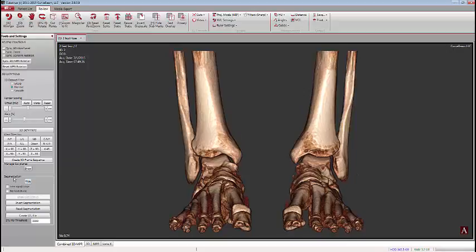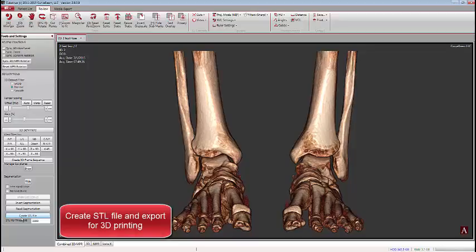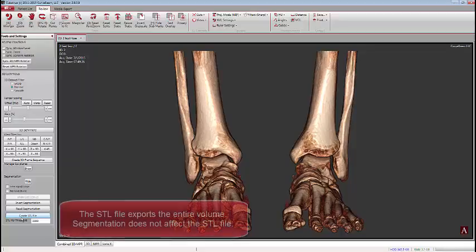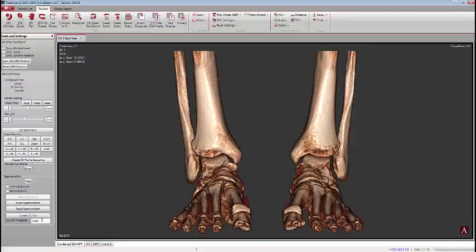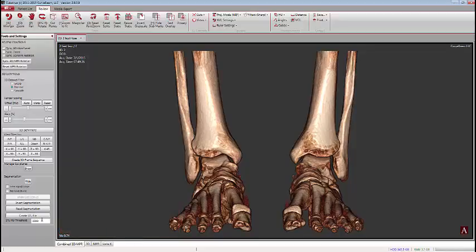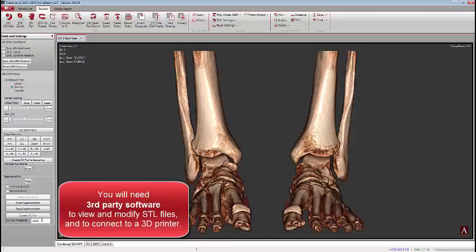Under the segmentation section there's also a tool called Create STL File. STL files are used to create actual solid objects using rapid prototype printing. To use STL file creation, you need to understand that it exports the entire volume — any segmenting done using Freehand Erase or Remove Bone will not carry through. The one adjustment you can make is to adjust the STL HU threshold, setting a number roughly 2000 HUs to approximate the density of cortical bone. You can then export the file, though you will need third-party software to view or modify it.